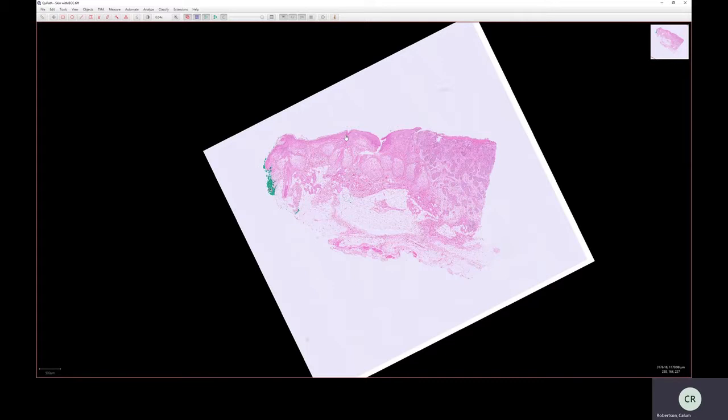Microns is another name for a micrometer. That is stained with whatever you want to stain it with. In the vast majority of cases, it's hematoxylin and eosin, or H&E, and that's what we're looking at here. H&E is a technique over 100 years old, which unbelievably we still use for the vast majority of our diagnostic work.